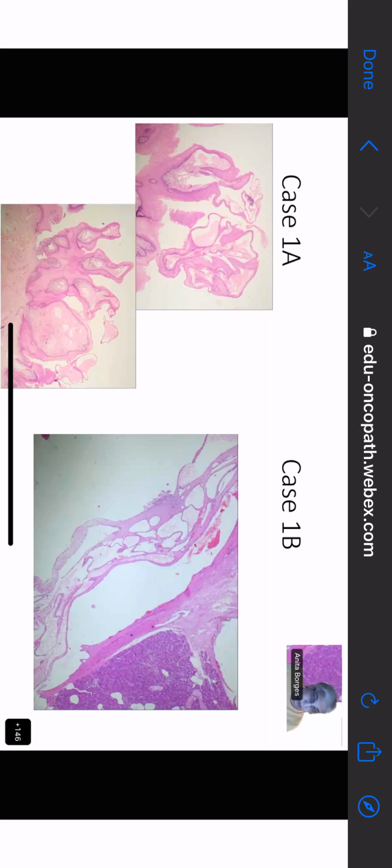So we want to try and assess what observations are going to be relevant to our diagnosis. We have to look at not only what we see, but also make an assessment of what we don't see and what we are expecting or should be seeing, but it is not there. Agreed? So it's relevant positive and relevant negative findings. All right, good. So far your description has been good.